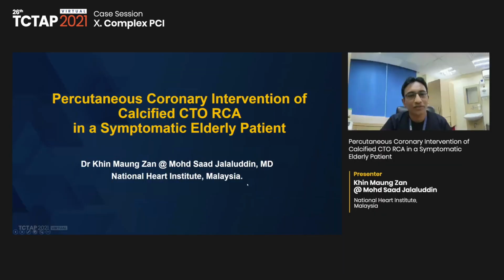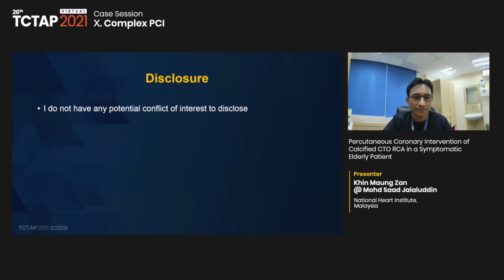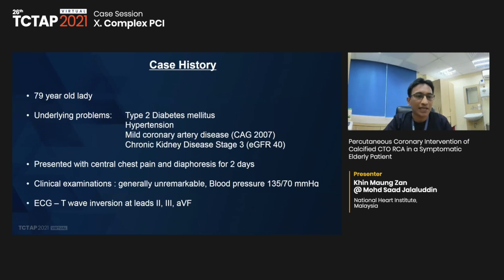From the first case, Dr. Zhang, please start your presentation. Hi, very good afternoon, moderators, panelists, and members of audience. I'm Saad from Malaysia, and I will be talking about a case of PCI to a calcified CTO-RCA in a symptomatic elderly patient. I have no disclosure, and my patient is a 79-year-old lady.